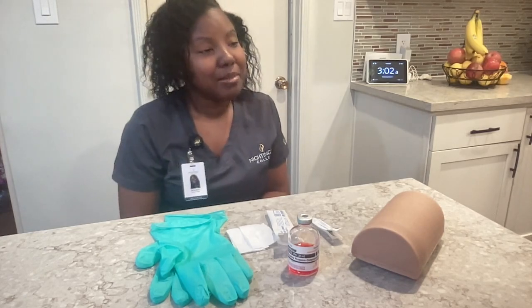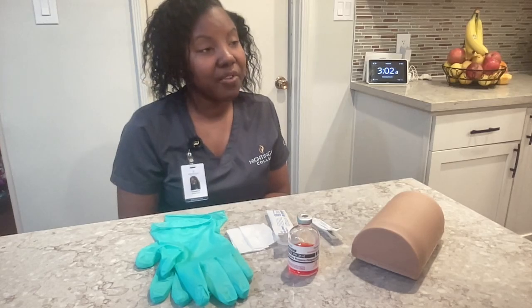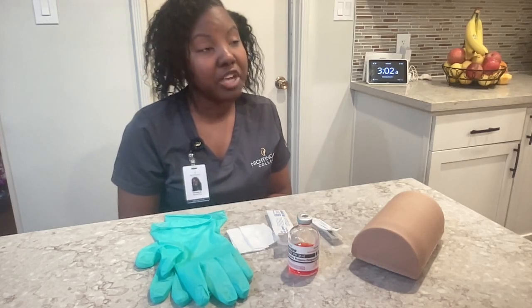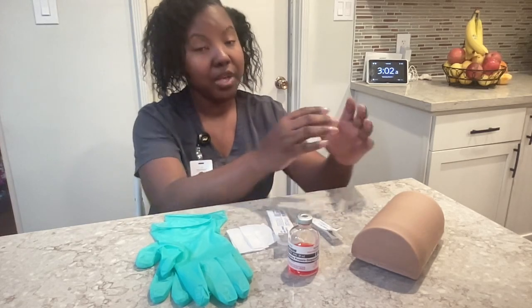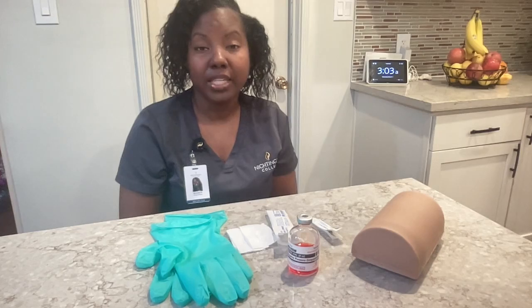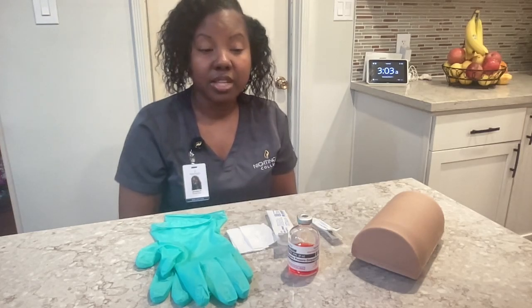Hello, my name is Michelle. I'll be your nurse today. Can I please verify your first and last name and your date of birth, please? Thank you. I've verified two identification identifiers.